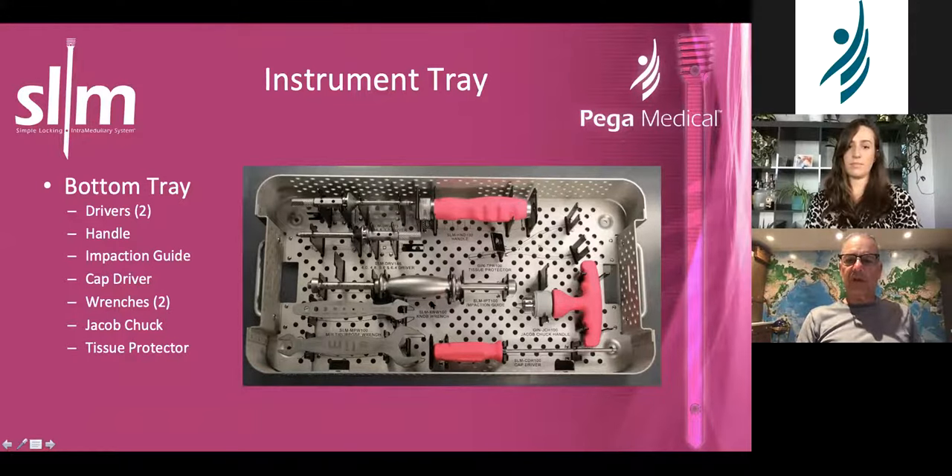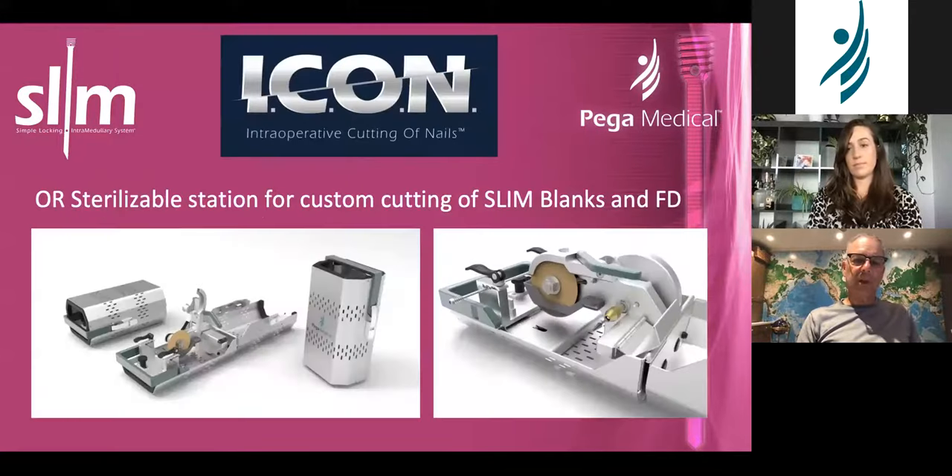These two wrenches are used to grab onto the instrument: the small wrench turns the knob if you can't turn it by hand, the bigger wrench turns the outer part if you can't turn that by hand. That is the small wrench and the big wrench, for the bullet and the capture. This is for the extractor — I use a mallet for insertion and don't use this, but I do use it for removal and I think it's very useful.